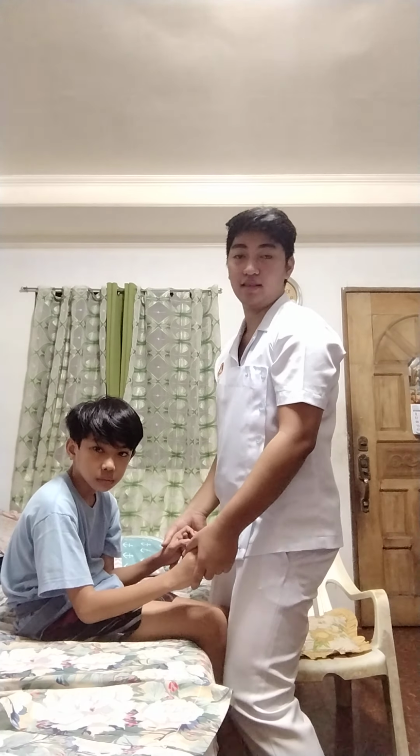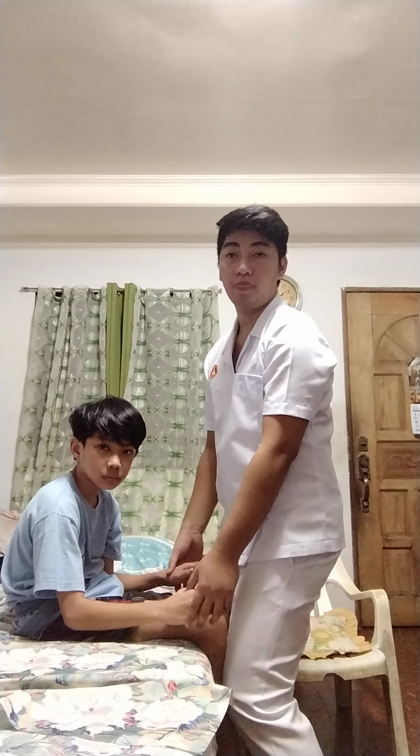And if necessary, have the second staff person grasp the guide belt on the opposite side, and using the guide belt, assist the patient to stand and rock back and forth while counting to three. And on the count of three, use your legs, not your back, to help raise the patient to a standing position.